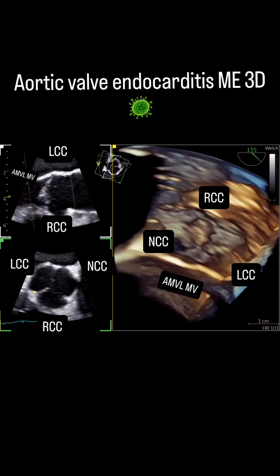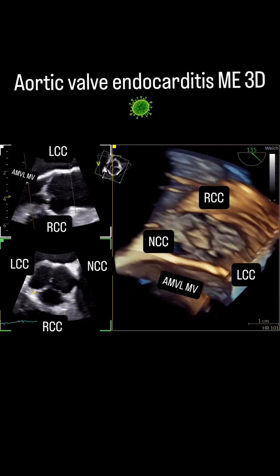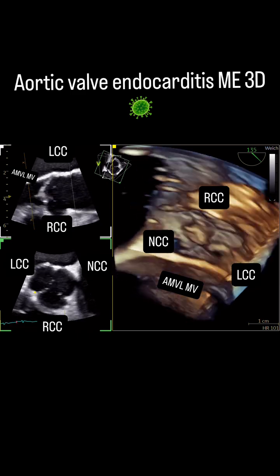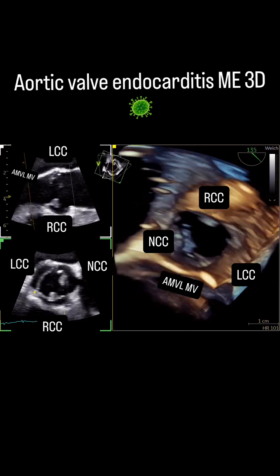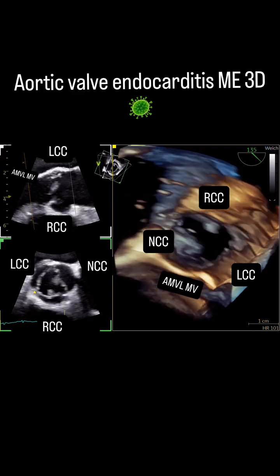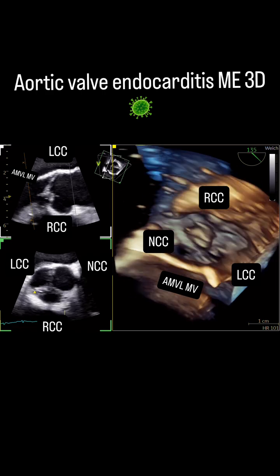Nowadays, 3D imaging should be part of each and every echocardiographic exam. In this case, we take a look at a patient with aortic valve endocarditis in the mid-esophageal 3D view. You can see on the left-hand side the long axis, the short axis, and on the right-hand side the 3D image of the short axis view.